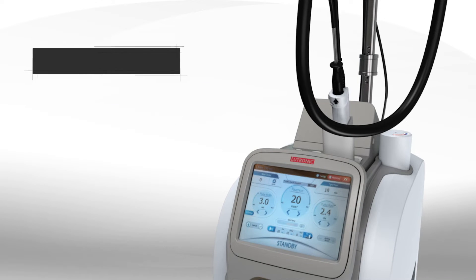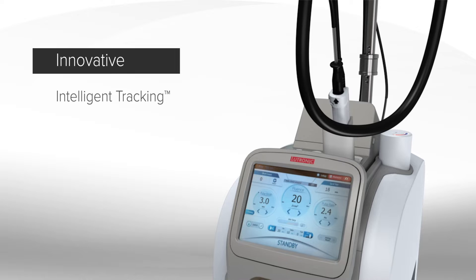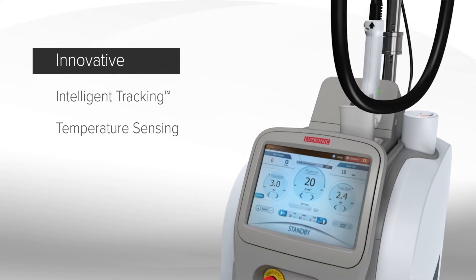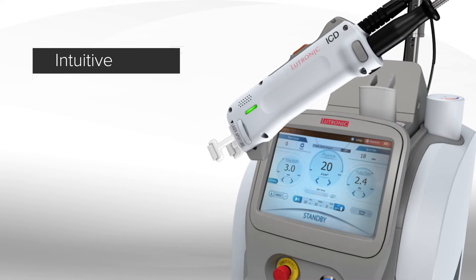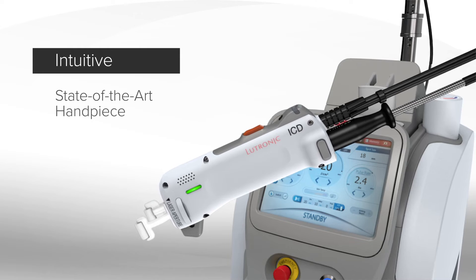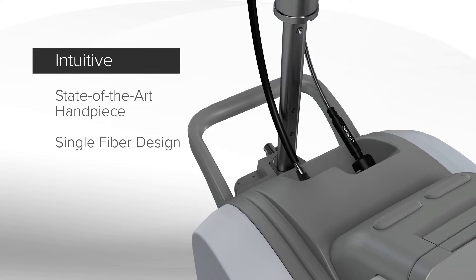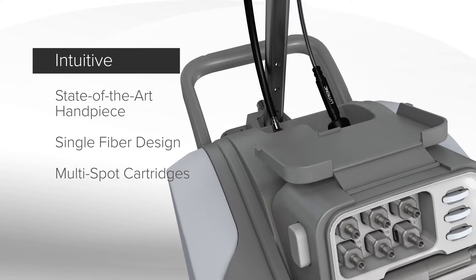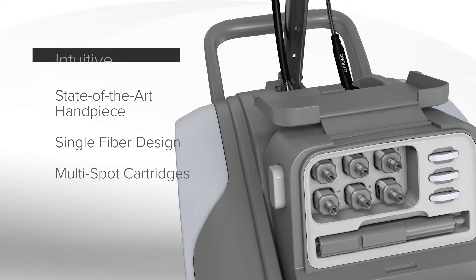Clarity 2 is innovative with its unique intelligent tracking and temperature sensing capability. It's intuitive, with a state-of-the-art handpiece and single-fiber design, supporting smart multi-spot cartridges ranging from 2 to 25 millimeters.